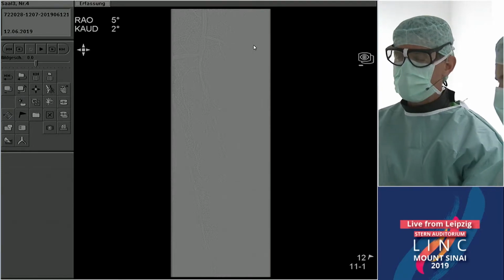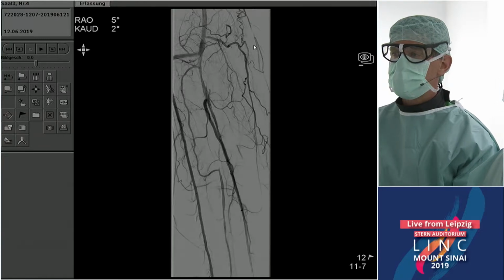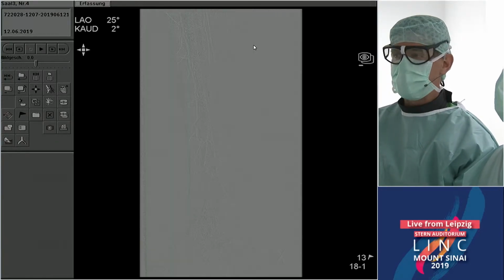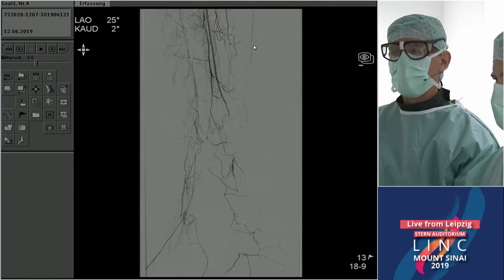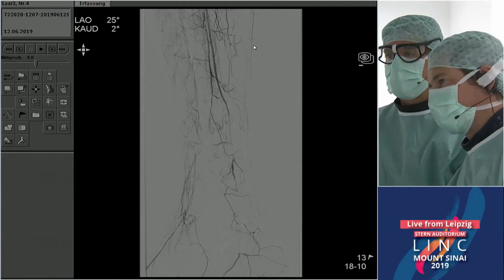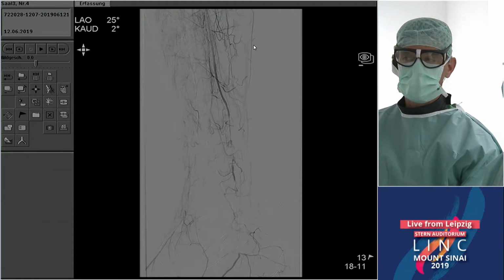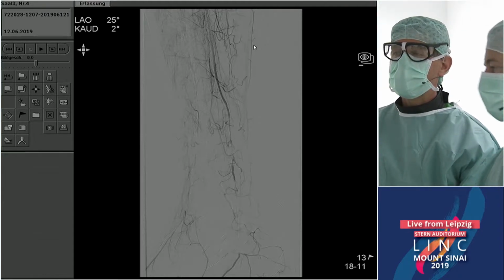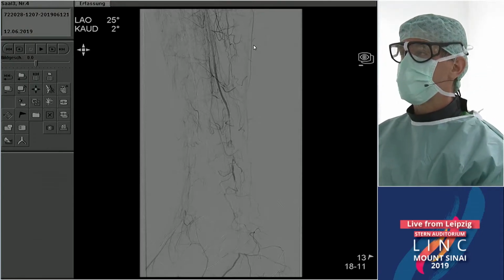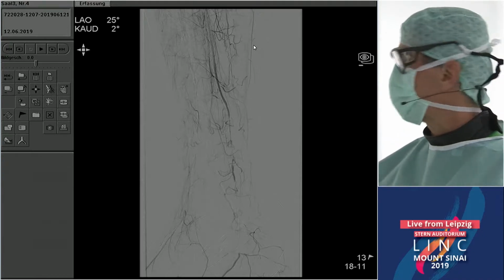So we ballooned everything with the AngioSculpt. Here on the angiogram there is already some flow, but distal complete spasm still. Some patients react with a lot of spasm to retrograde puncture, also to compression with the finger. We had good back bleeding when we took the sheath out, so I'm convinced nothing is wrong here. We also gave some nitro. However, the patient's blood pressure dropped quite significantly.